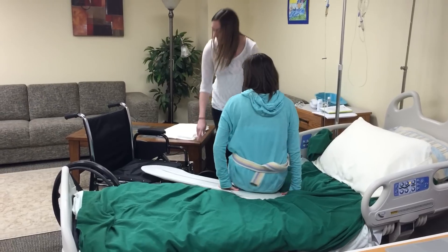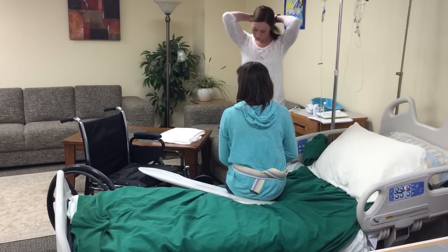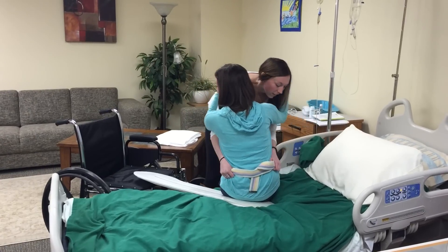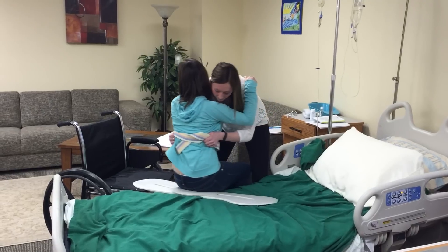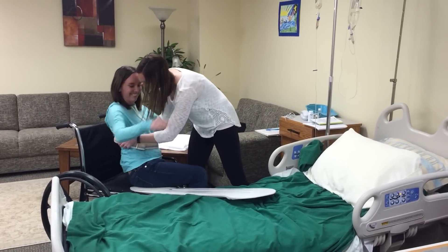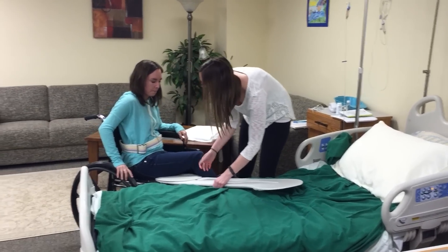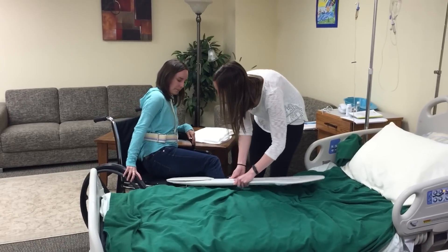Make sure that the brakes are locked as well. Then go underneath your patient, grab them by the belt, and just slide them over. If you can, help them get back into the chair if needed. Just have them lean to opposite sides and wiggle it up.